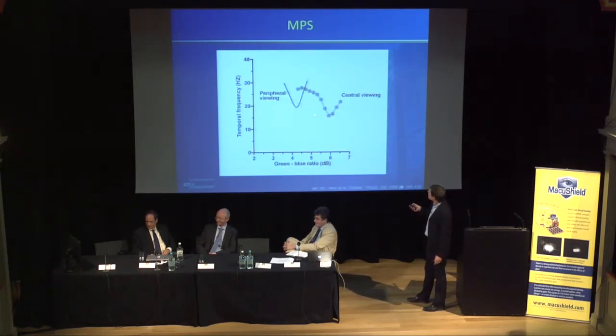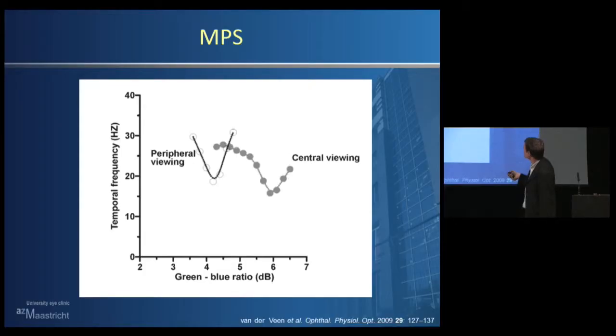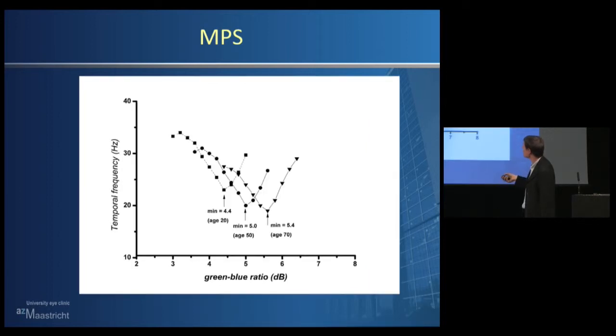So this is going from the central to the periphery. Then less macular pigment is there, so you need more bluish light in going from here to there. If your lens density would increase, then you would also expect a shift going to the right, and that's exactly why you need this peripheral test, because you cannot rely in principle on this measurement only.